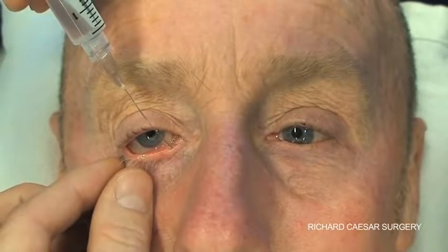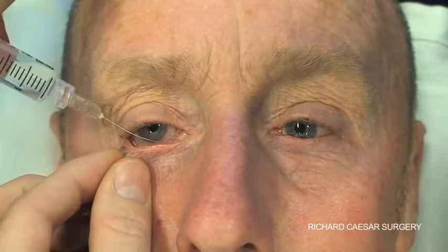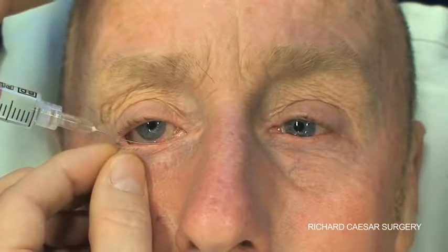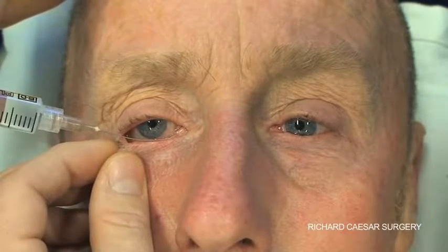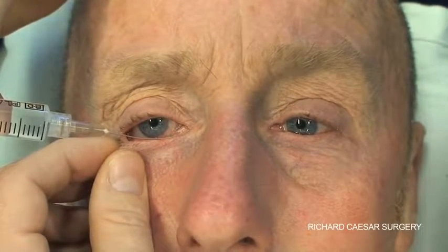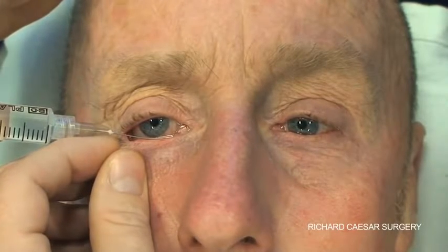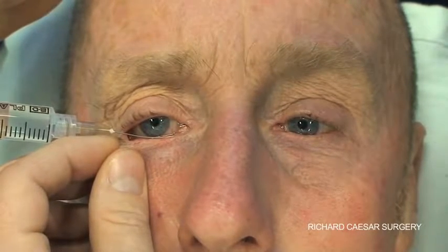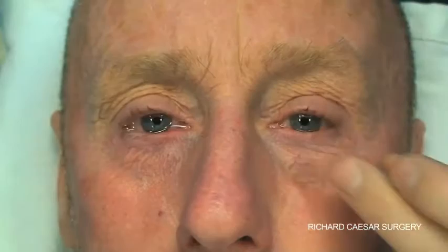If you're right-handed, stand behind the patient. For the right eye, put the lower lid on tension with your left hand and hold the syringe ready to inject with your right hand, depressing the plunger with your forefinger. Rest your wrist on the patient's forehead, and that way you can perform the change of direction by simply rolling your hand round the side of the patient's forehead.